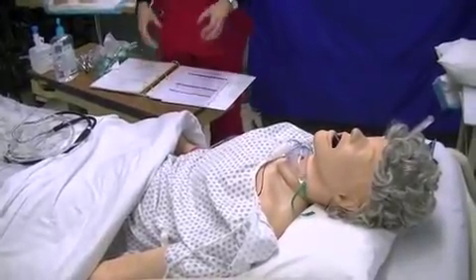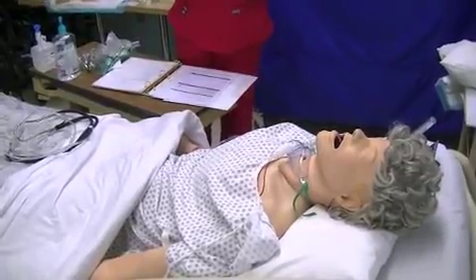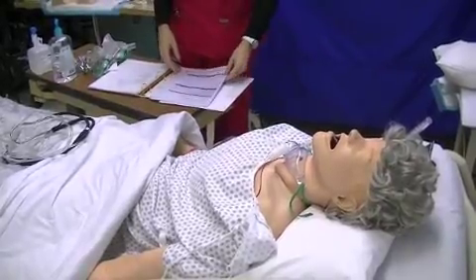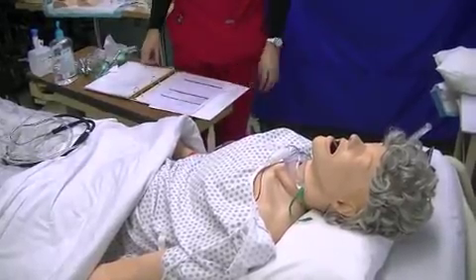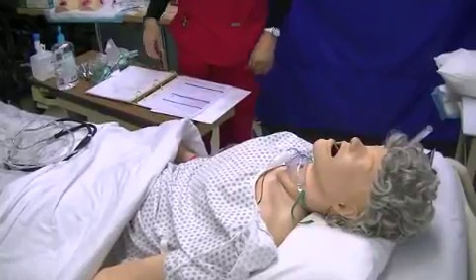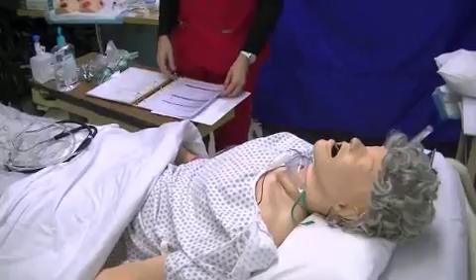And we're going to keep monitoring behind the cheek, under the cheek, or the chin, on the cheeks, and also behind the ears. We're going to look for any problems with skin breakdown. And we're going to also notify the doctor of any respiratory problems or any problems with oxygen, or if they need a prescription of oxygen before they go home.